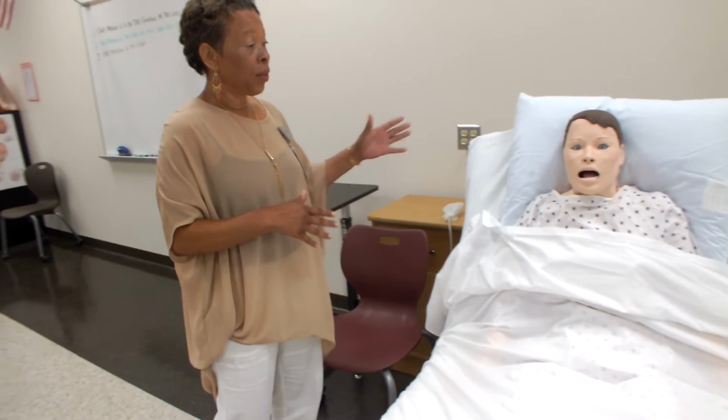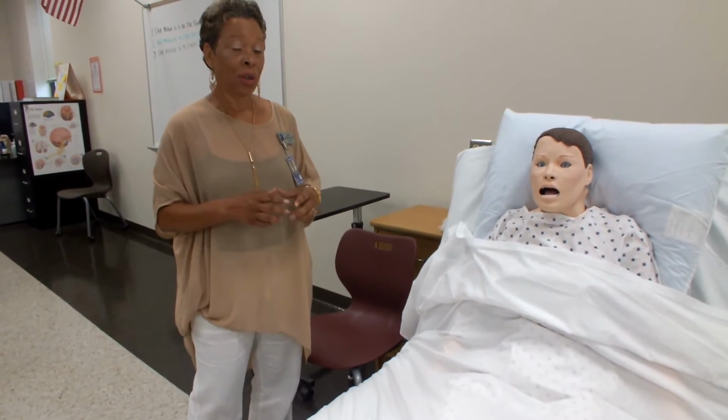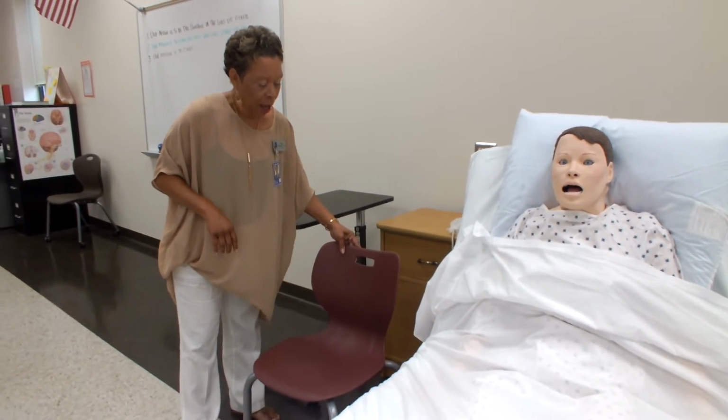So actually, the raising of the head of bed to a high Fowler's position is the critical element in this skill, okay? So you want to make sure that you don't give the NAE any room to question whether or not you have raised the head of bed to a high Fowler's position, okay? Now I'm going to talk to you about the chair.